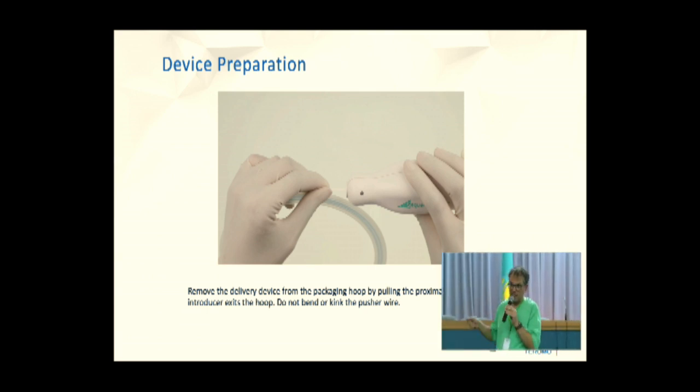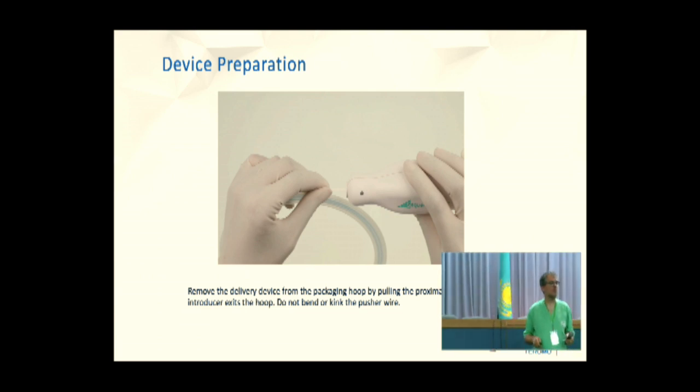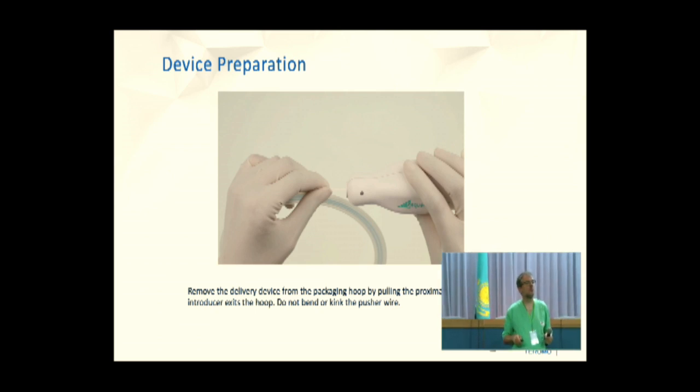If the light is red, exchange the detacher first. Try a second detacher. If the second detacher shows you a red light, exchange the web. Before you use the second one, I would dry it. Yes, if it's wet, then you can have the red light. You're so right, I mean, dry the connector. Always, before you put the detacher on, always wipe it dry. There is an urban myth that a little bit of water helps the connectivity. It's not true. Electricity and water are not good friends. I mean, they are good friends, but not in our sense.